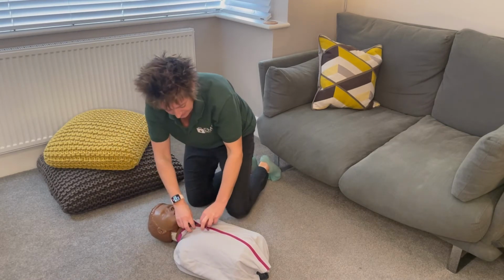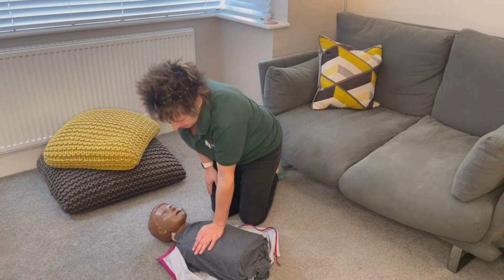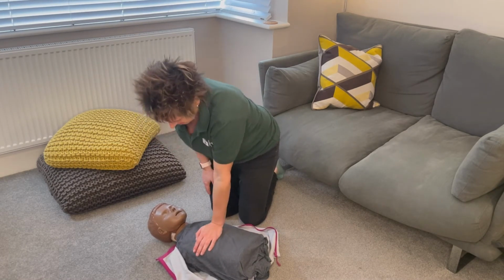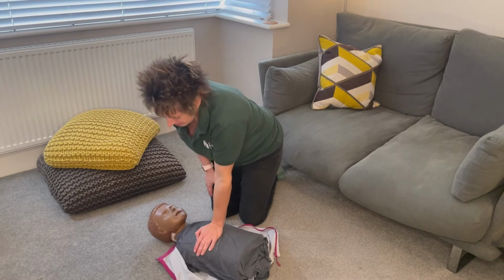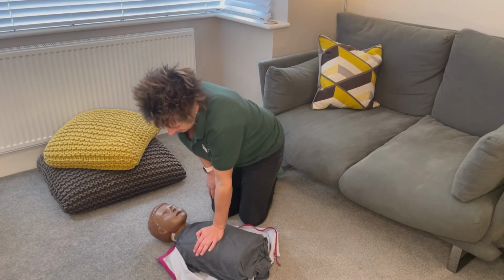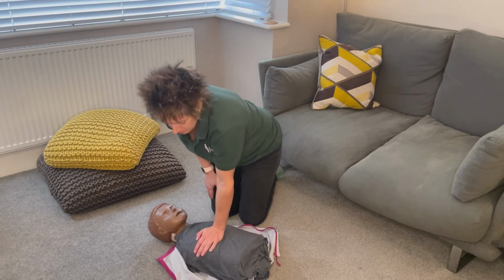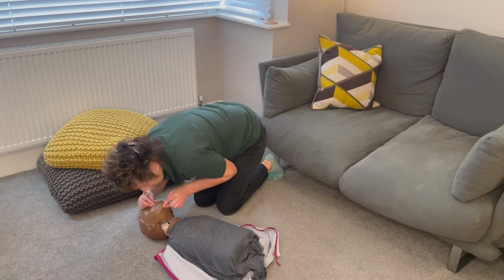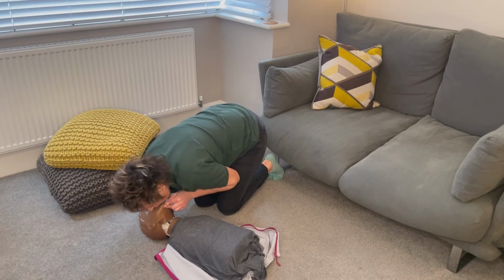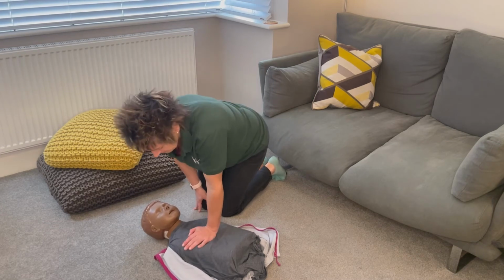After my 5 rescue breaths, I will then do compressions using the heel of one hand. Now I've got no scissors with me, so I'm just going to remove the casualty's jacket because I can unzip that and do compressions with the heel of one hand, 30 of those at the speed of 100 to 120 beats per minute. And then I will go and do 2 rescue breaths. And I'm going to do that 3 times, 3 cycles, which is 1 minute.